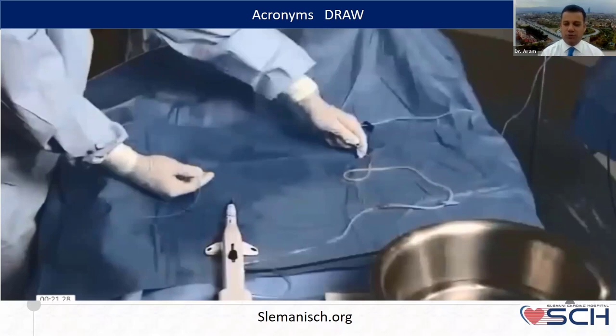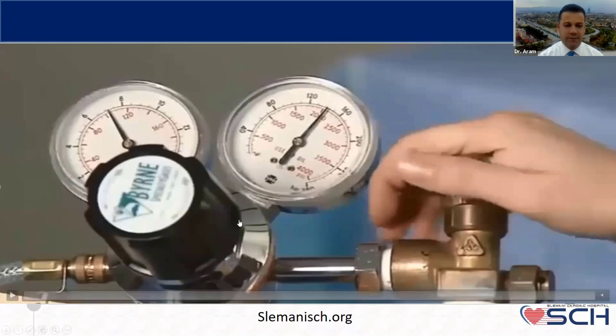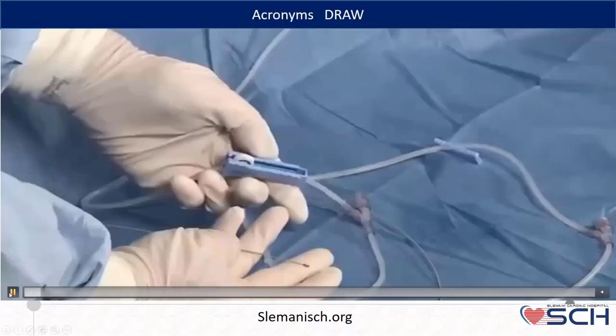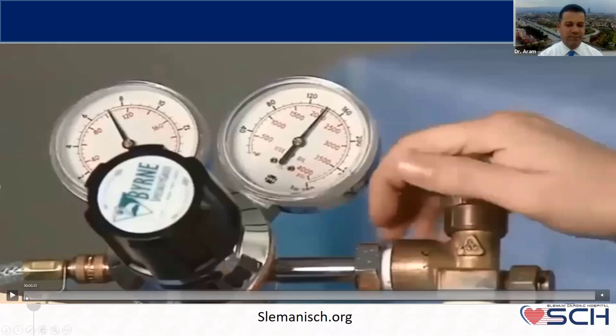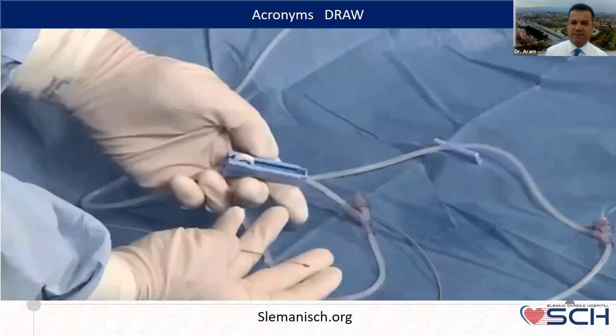Here we are going to cross the wire to the lesion. Before we start, this is very important: all the time, please remember the drill. I remember that day Dr. Amjad told me, Aram, never forget the drill. The drill is to test and prepare, so at that time you make a double check that everything is ready. We know that we have arranged everything.